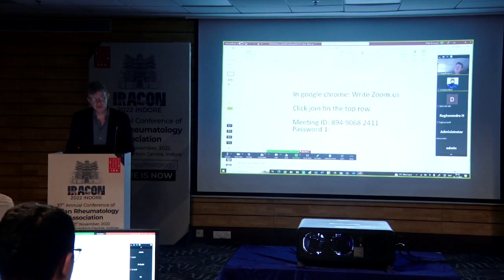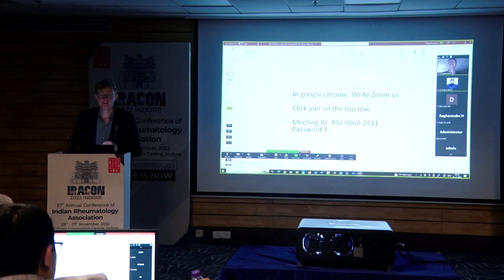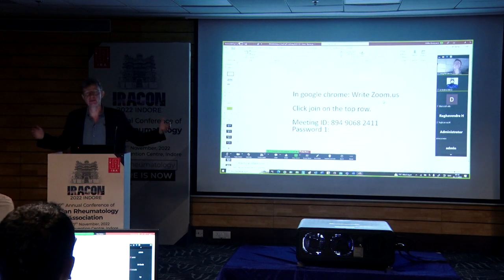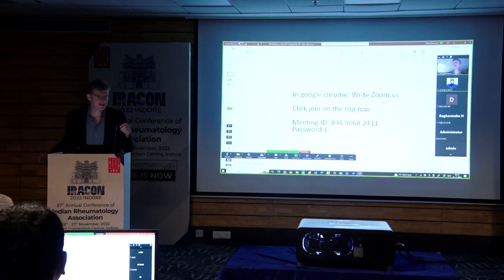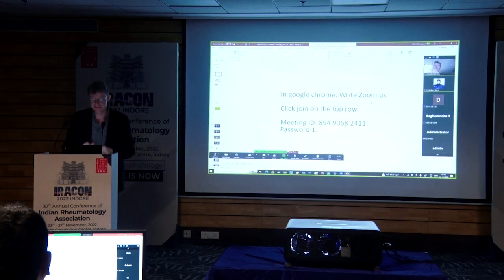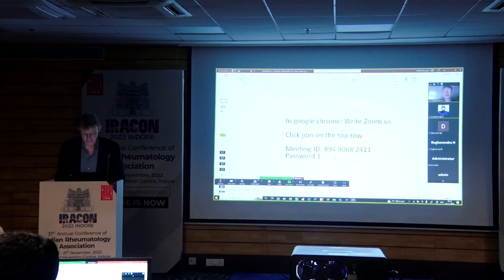So, obviously those who need what I'm writing here haven't done it yet, but that's an option that you can see on the screens in front of you. It may not be important right now, but it may be nice when we go through images at a later time point, where you may see that there's a joint here on the screen, but you can't see the details. So I think that will be helpful, particularly the further back you are.